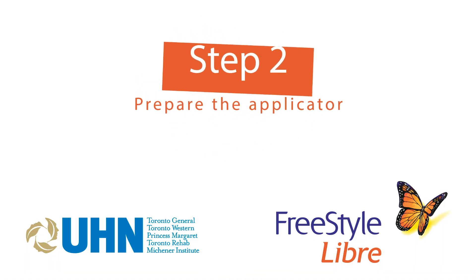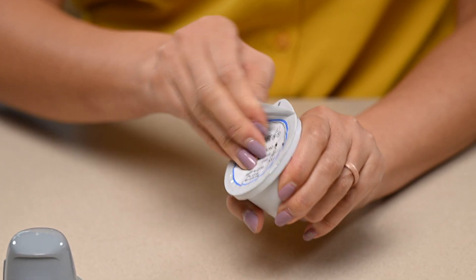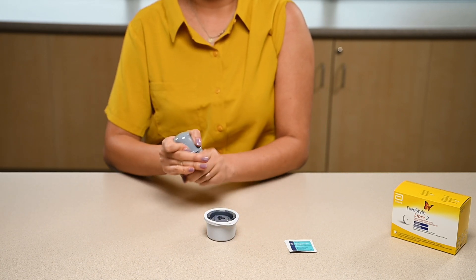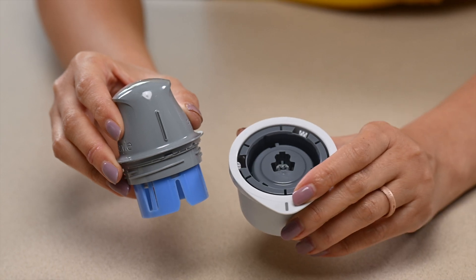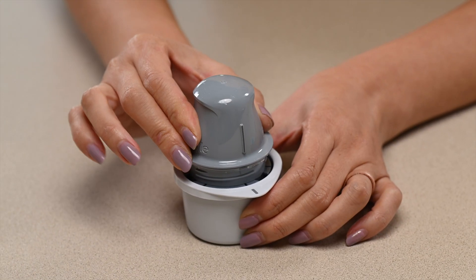Step 2: Prepare the applicator. Peel the cover off of the sensor pack and place it on the table. Unscrew the cap from the bottom of the sensor applicator. Line up the mark on the sensor pack with the mark on the applicator. Press down firmly on the applicator.